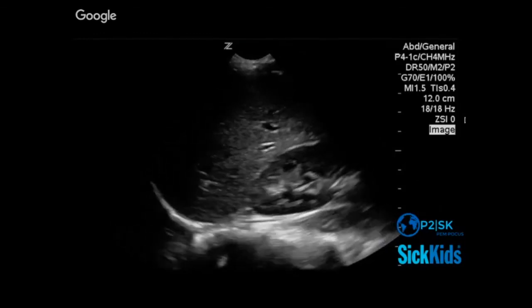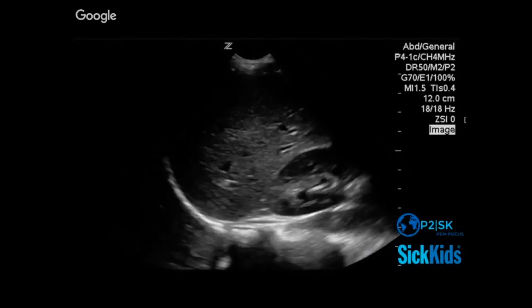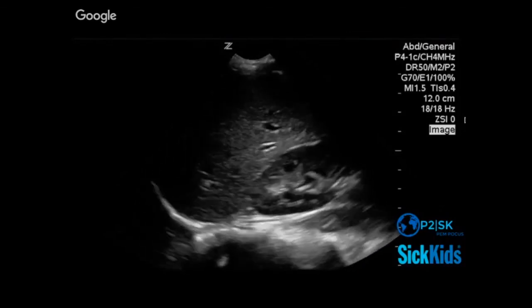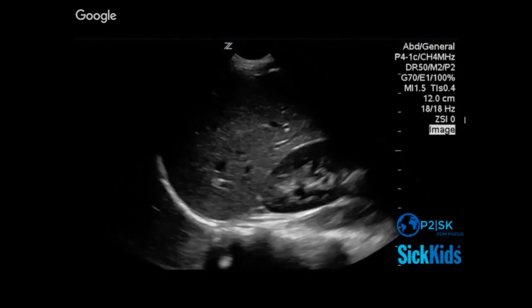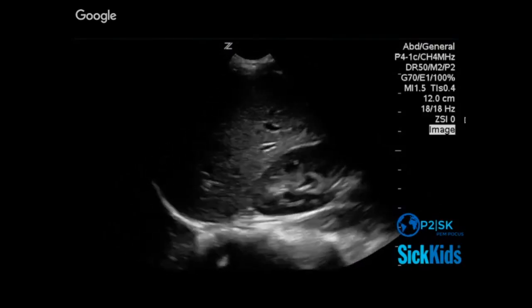And this view I put in because when I talk about, you don't need the fast exam integrated, but you do need to be doing lungs as part of your view. I incorporate often, I've done my low frequency probe maneuvers that are my cardiac scanning. And before I switch to a linear probe, I just, let's take a look for effusion, right?